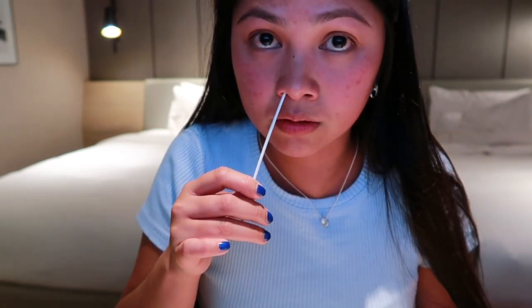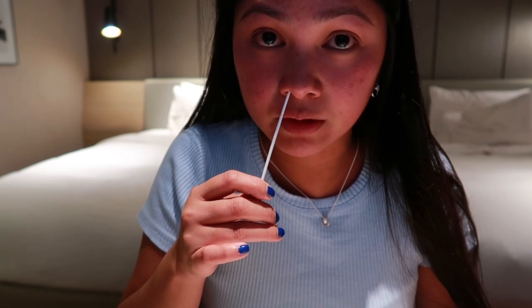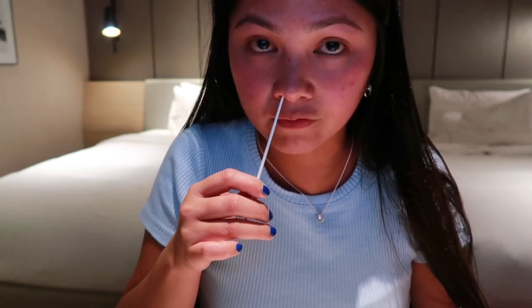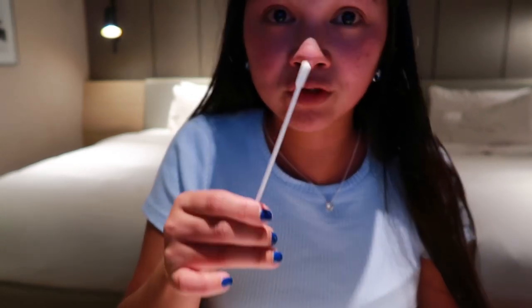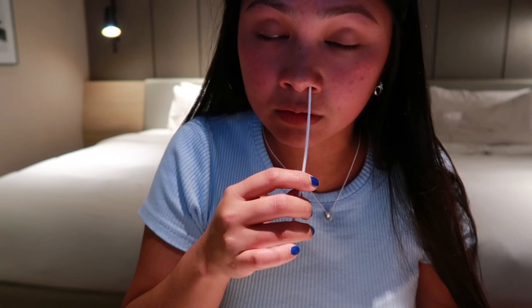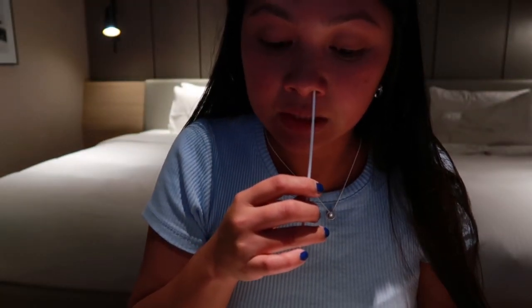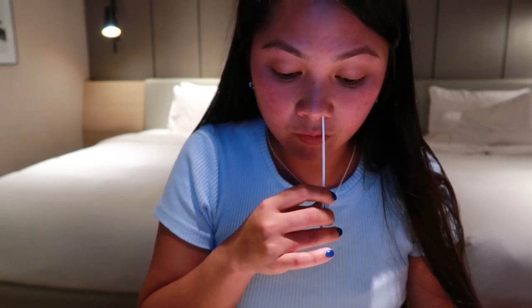Doing the first nostril now — counting: one, two, three, four, five, six, seven, eight, nine, ten, eleven, twelve, thirteen, fourteen, fifteen. Then doing the other side — it's a bit difficult, weird feeling. One, two, three, four, five, six, seven, eight, nine, ten, eleven, twelve, thirteen, fourteen, fifteen.